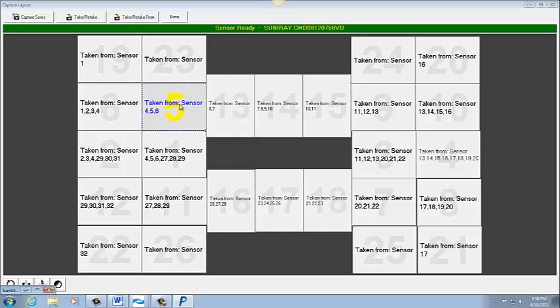Okay, so my sensor is ready, so I'm going to go ahead and expose an image real quick here. Alright, and your image will pop up, and because, like I said, it already has its own little system where it's going to jump to the next one for you, if you want to stay with the series that it has, you don't have to do any clicking. You can just go to the next one.